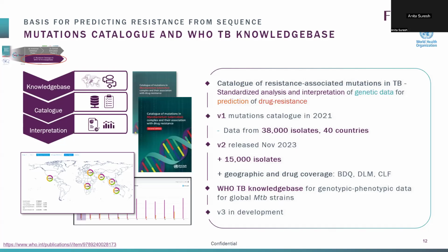This allows you to do a very standardized analysis and interpretation of the data, so you can predict drug resistance from sequence information. This is something you as a lab user may not necessarily use directly, but certainly the companies that are building a TB assay are using this as their blueprint to design their assay. In addition, as researchers conduct surveys or sequencing projects with samples, that data also goes in here, because it's valuable. If you start to see a mutation emerge in a particular region, over time you're going to see more of that, right? The frequency of that increases over time.